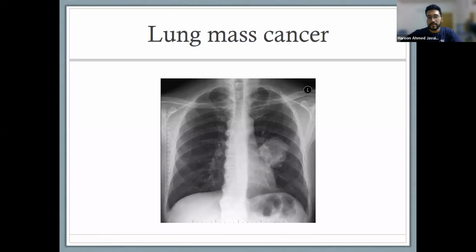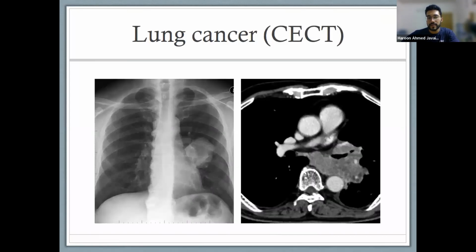So talk about cancer. Let's say we have a patient who was symptomatic, had a chest x-ray, and they found this mass over here, right? And we're suspecting lung cancer. So what's the first thing that they do? They do a CT scan, okay? And again, since we said this is cancer, they would do a contrast enhanced CT scan.